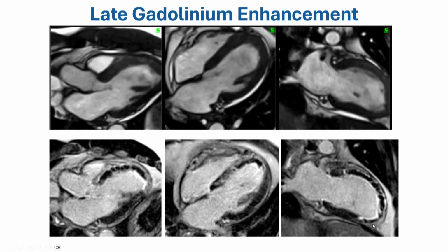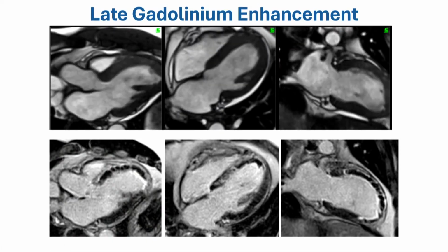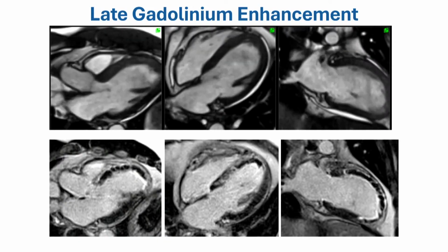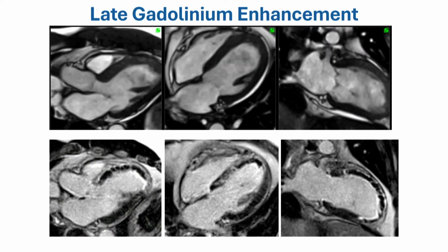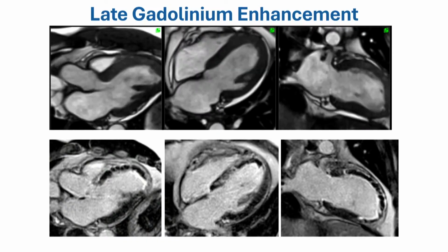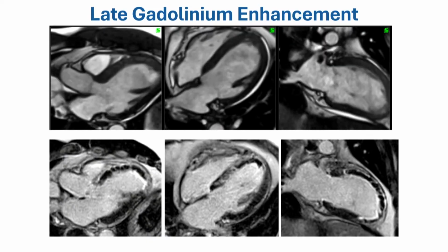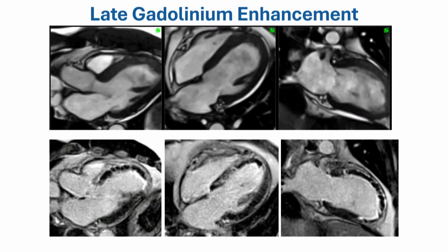In MRI, we're able to identify the scar and the thrombus. So this is not the typical scar that you're used to seeing on MRI imaging. Even for us, when we get an MRI, it's usually somebody with, let's say, CAD, three-vessel disease, and we have MRIs for viability, to decide on a reperfusion strategy. So usually the way we see it is a little bit different, and I'll show you a different example.